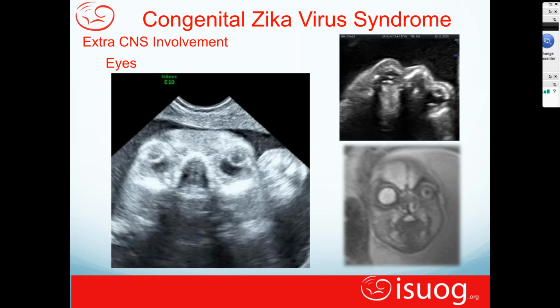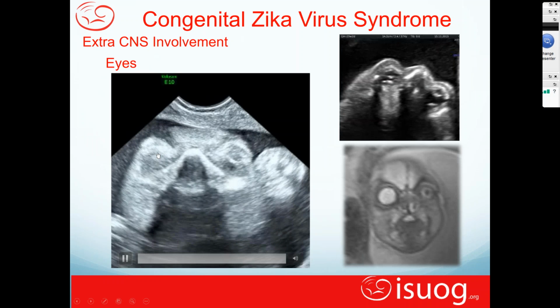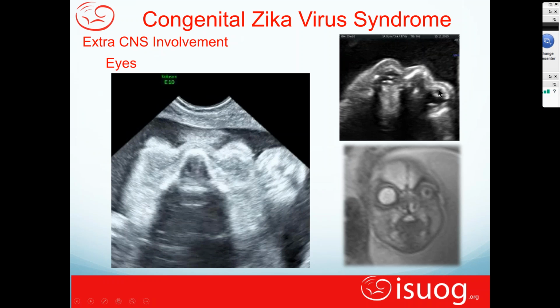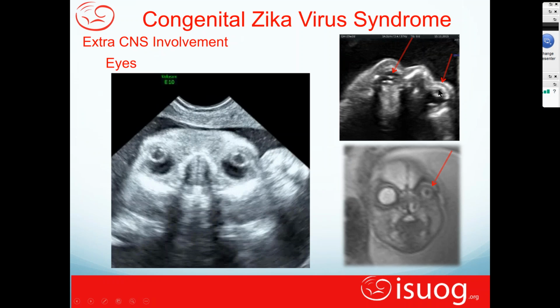There are also ocular changes. Here you can see actually a cataract form. Here are changes in MR that you can see in the eyes. There's sort of a graying and opacity that you can almost see on the ultrasound as well of these babies.